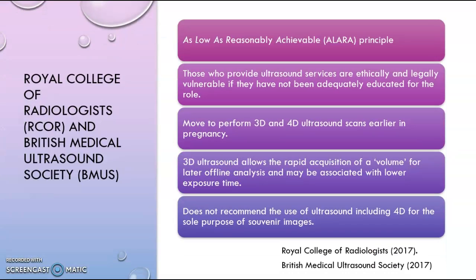The British Medical Ultrasound Society produced the guiding principle for radiation safety, as low as reasonably achievable, known as the ALARA principle, meaning if the scan has no direct benefit and if it is a minimal exposure, it should not be undertaken. In the 2017 publication, the Royal College of Radiologists warned that those who provide ultrasound services are ethically and legally vulnerable if they have not been adequately educated for the role. They caution that nurses learning the scanning technique of a specific anatomy risk misinterpreting other issues. However, they have not acknowledged the benefits of having an advanced nurse practitioner in this role.